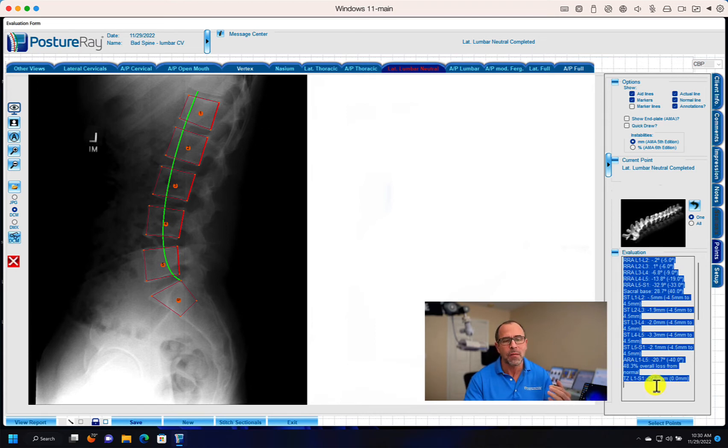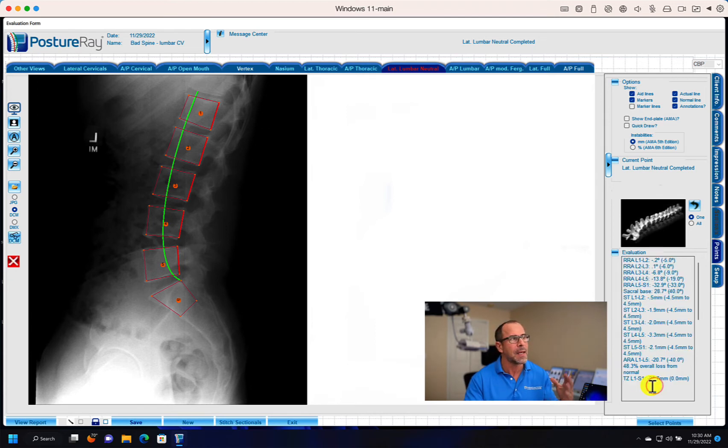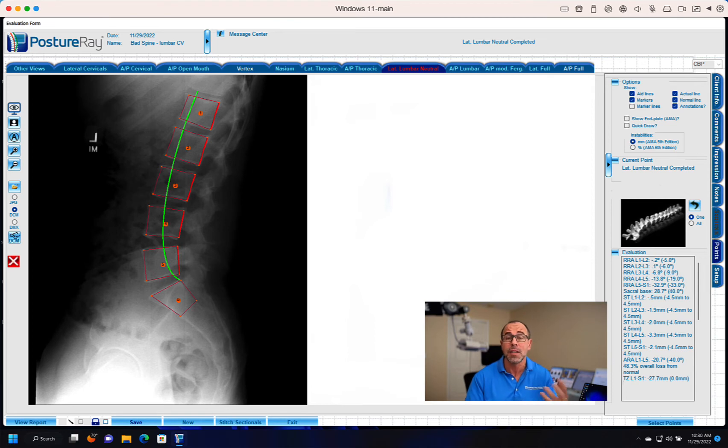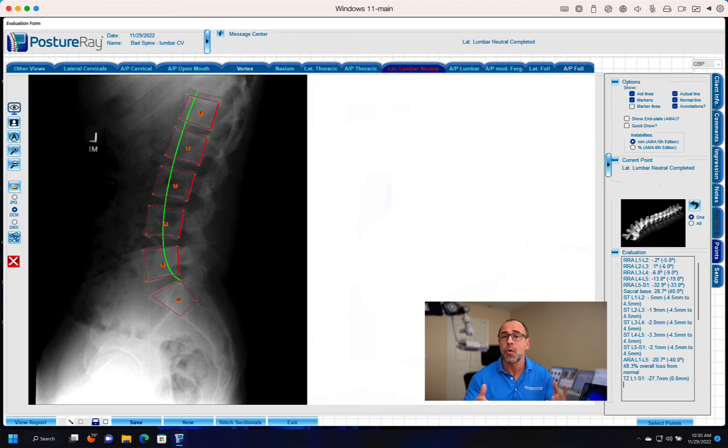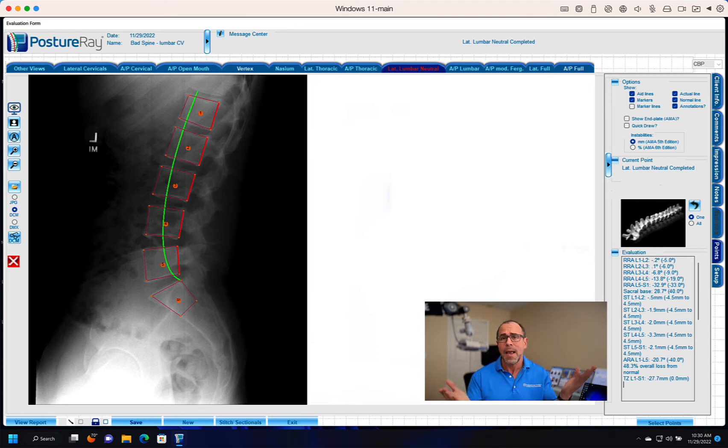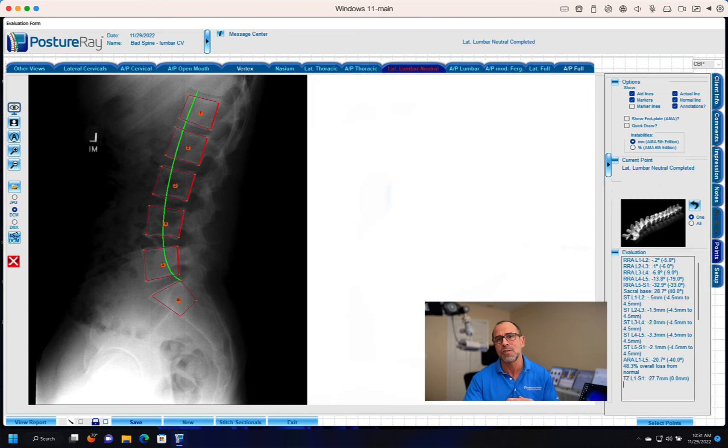And of course, the best of all is that if you want to adjust any of these points, you as the clinician should always double check things and move accordingly when you see any discrepancy. Then it's a complete measurement of your patient's spine.